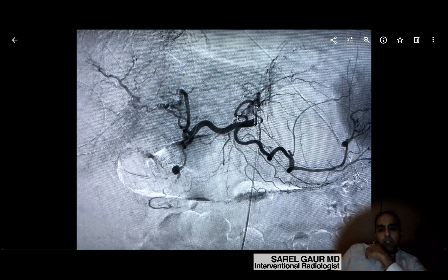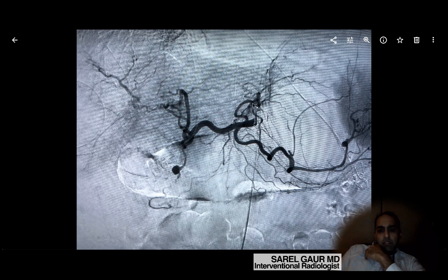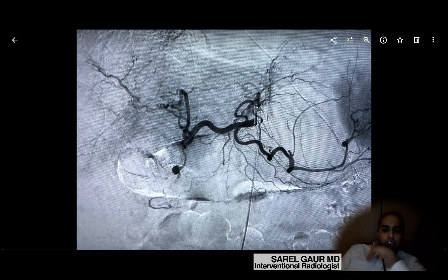A little bit harder to see, but right here is the left gastric artery. You can actually see these branches radiating out and supplying the stomach. If you look back at this whole image, you can make out the outline of the stomach — it's this big bloated structure. You can see how these vessels course around and supply blood to the stomach. So the celiac artery main branches are: left gastric, splenic, common hepatic, and proper hepatic coming out here.